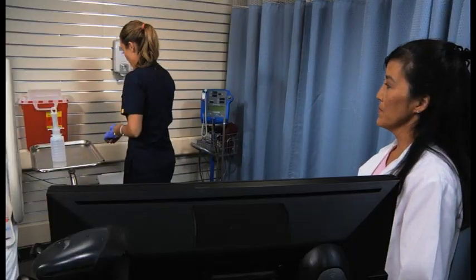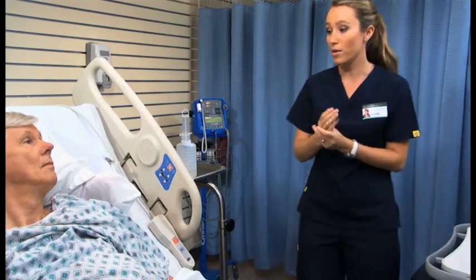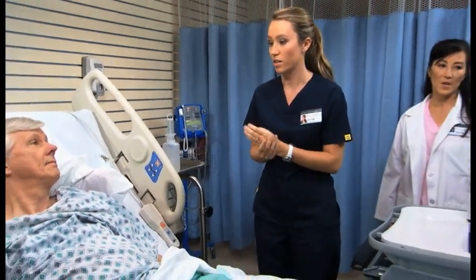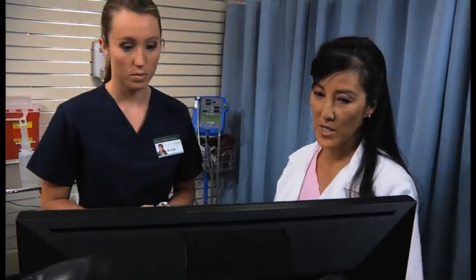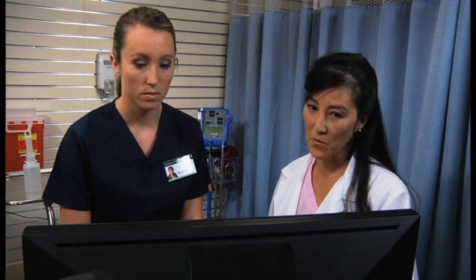Right. Mr. Lumet, how are you feeling? Good? So now you document the administration of the medication. Remember, you'll want to evaluate the patient's response to the medications within the appropriate time frame for the drug.